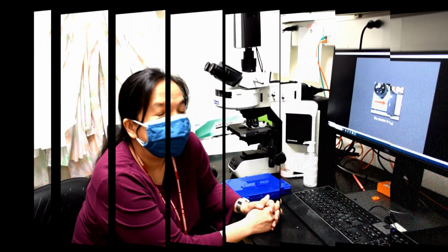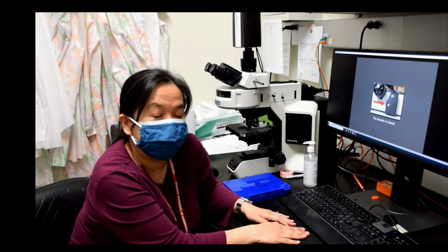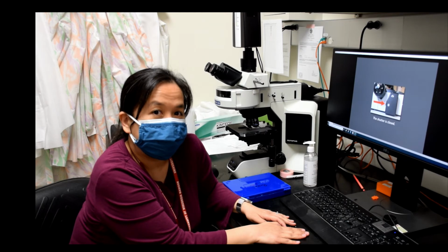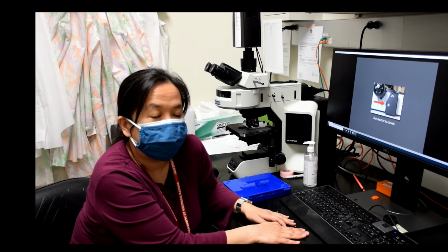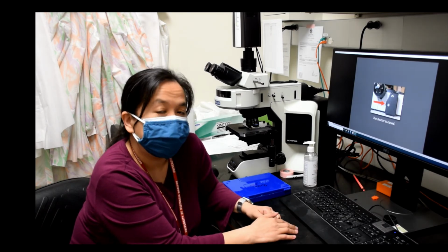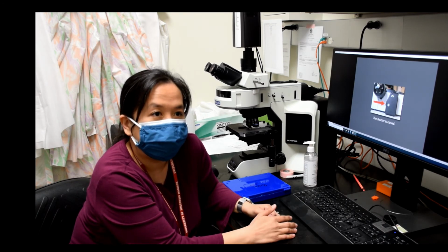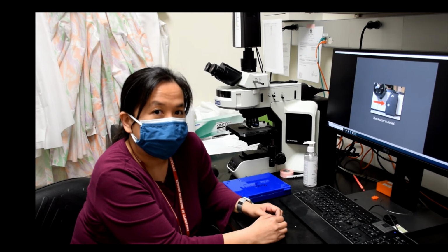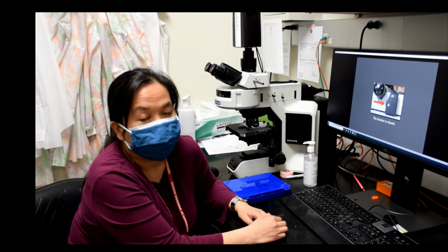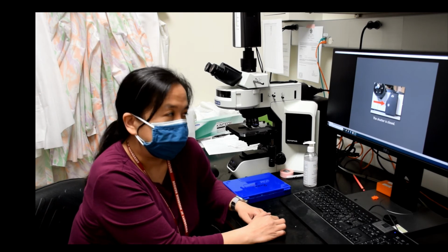Hey everyone, my name is Teresa. I'm a scientist in the lab, and what I'm going to show you right now is how we do some imaging. So you should have already seen how the tissues are stained using something called DAB, and that shows a staining on the slide under white light. What I'm going to show you here is how we can do the same technique, but now use fluorescence. And with fluorescence, we can see many different proteins on the same slide because now we can look at different colors. So with this microscope, we can actually look at up to 9 different colors on one slide. What I'm going to show you is how we do the imaging for that.